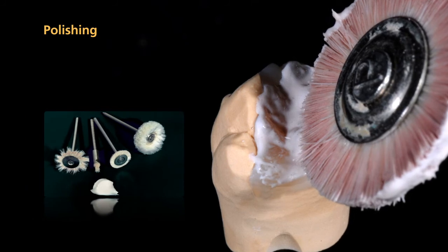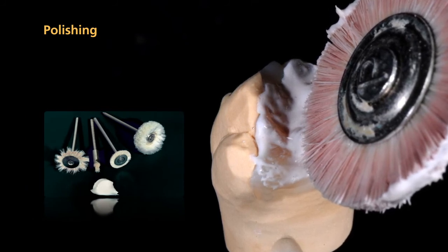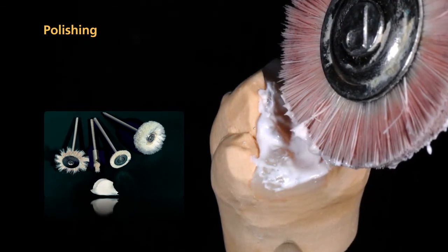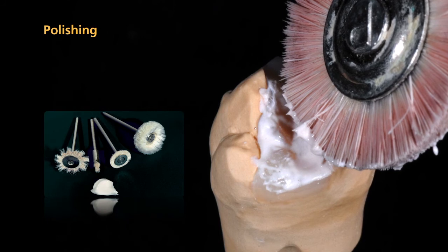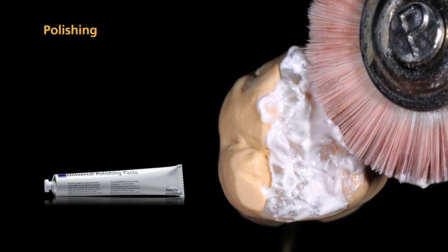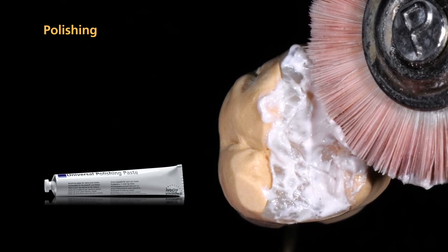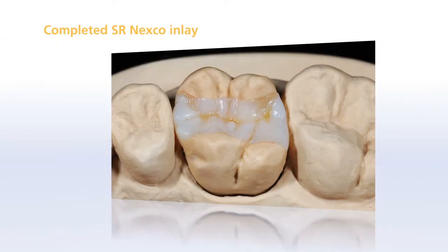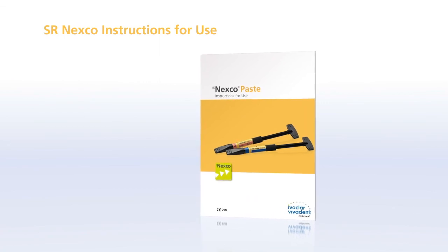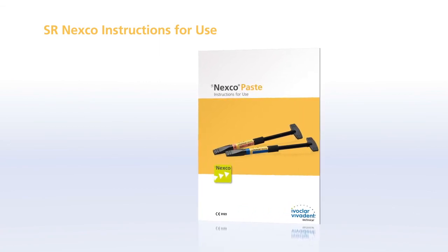Pay particular attention to the margins to avoid rendering them too short. After you have smoothed out the restoration, polish it. Utilize a handpiece and suitable polishing brushes and buffs at slow speed and light pressure for pre-polishing and high gloss polishing. Use universal polishing paste. Do not use a polishing motor to polish SR Nexco restorations. Please note that an adhesive cementation protocol is mandatory for framework-free SR Nexco restorations. For more information on the application procedure, please refer to the SR Nexco instructions for use.